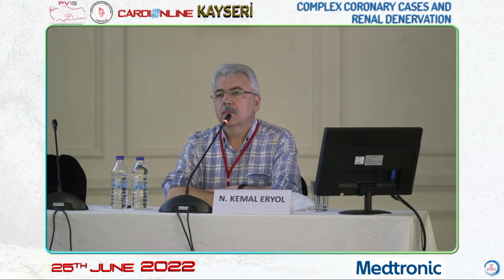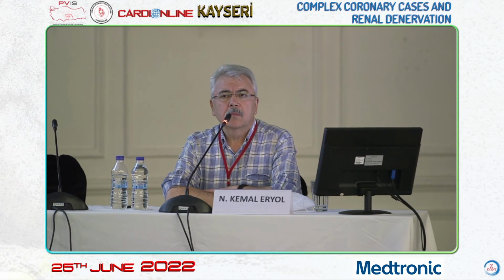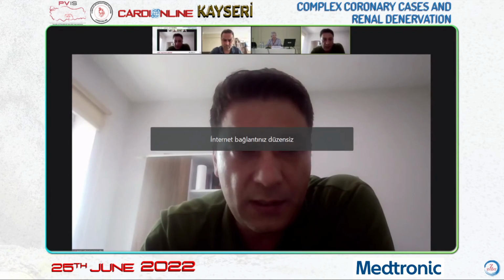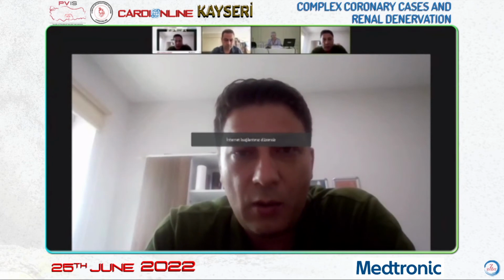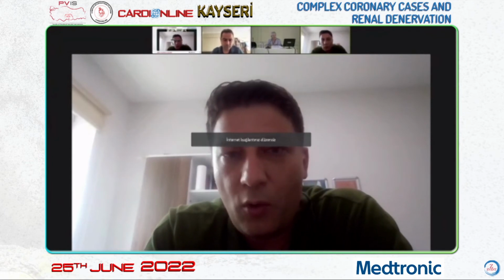Zeki, thank you very much. In the use of these balloons, about the preparation of the lesions, can you inform us, please? Do we need to prepare the lesion, and what kind of a strategy should be adopted? We require a good lesion preparation with a semi-compliant balloon, if necessary with an NC balloon. And 1-to-1 preparation is required.